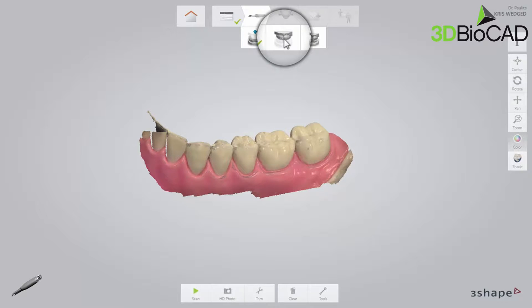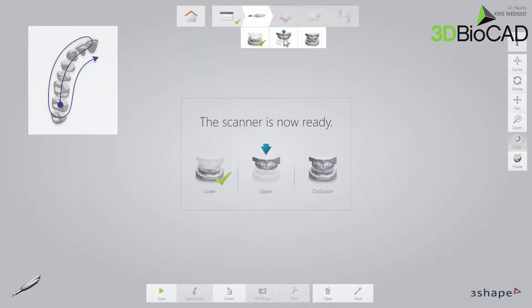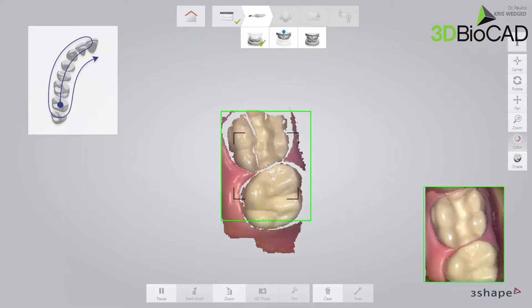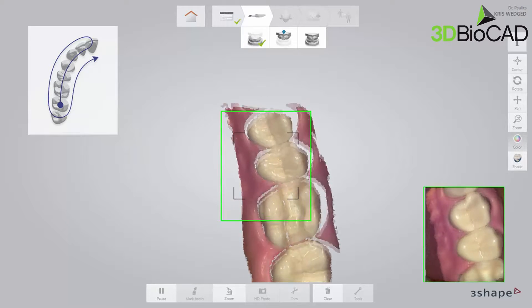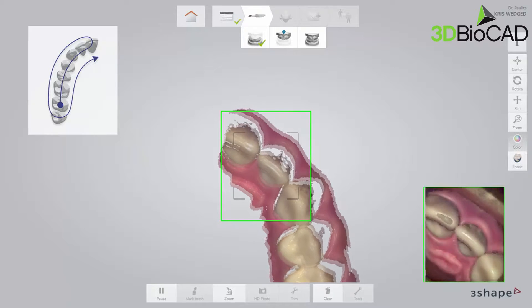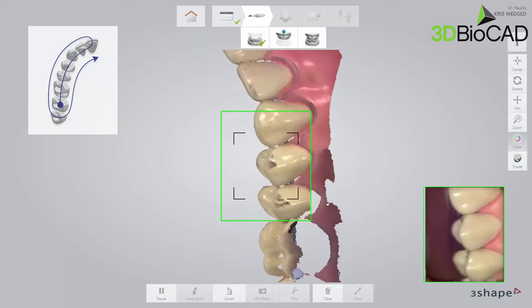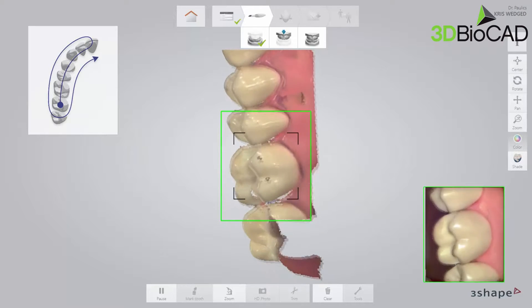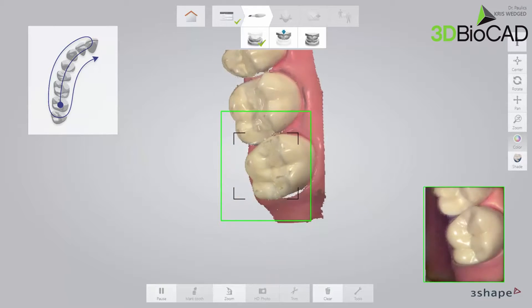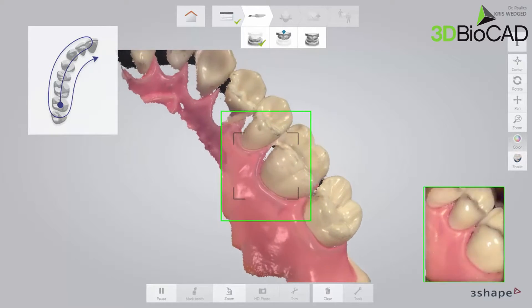Now proceed to the upper arch. Scan the same area as in the lower arch. Follow the official scan strategy: start by scanning the occlusal surface from the molar to the canine. Then, as it is the upper arch, slowly roll to the buccal side and move the scanner in the distal direction. Finally, slowly roll over the last molar and scan the lingual side.